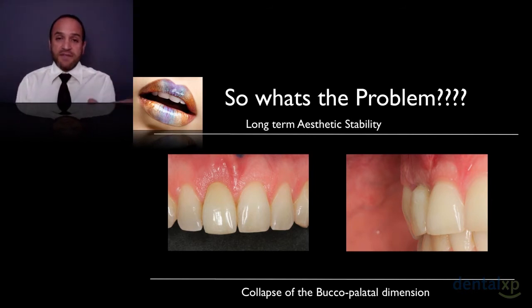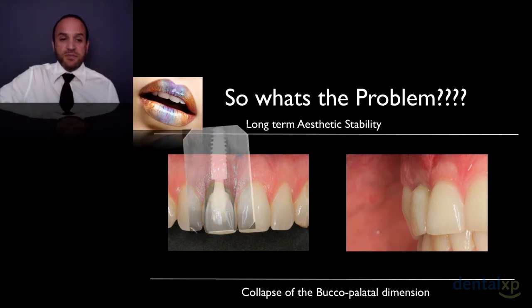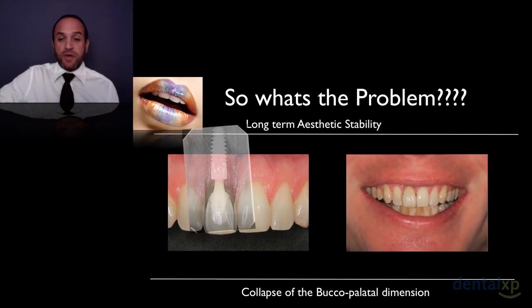So you are dealing with a concavity versus a convexity, and as a result of that, the light reflection properties are different. And with that implant in position, you now have the scenario on the right where when a patient smiles, you can start to see this dark grey shadow underlying the lip, and with higher lip lines, it's even more prominent in these cases. And it's often the first wedding photo or some photo that they've been out to with a friend, whereby they come back and they say, whoa, hold on a second, there's something wrong. I can see the implant shining through. And it's not the implant shining through, but it's more the greyness of the shadow that comes because of the different light reflection properties. Again, this becomes a huge problem for the patients and something we need to know about, and we need to discuss with our patients from the start so that we understand that there might be this problem.